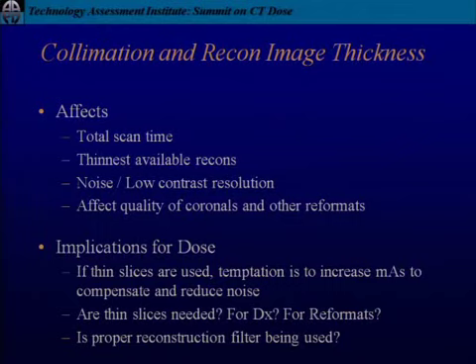If you need thin slices, then obviously it's something very subtle. So why don't you need to increase the mAs or slow down the pitch or do whatever you need to do to give you better signal quality, better signal to noise? On the other hand, if it isn't necessary, then why not knock down the dose on the thicker slices so that you get poorer signal to noise there too?